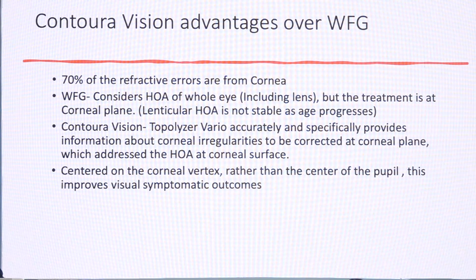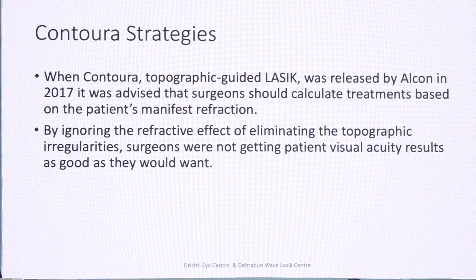Customized wavefront guided treatments would also include the lenticular aberrations. So if you have lenticular aberrations and you're trying to correct them on the cornea, it seems to be counterintuitive anyway. So Contoura, when it was born, was by Alcon in 2017. They advised that treatment should be calculated based on patient's manifest refraction. And by ignoring the refractive effect of the topographic irregularities, surgeons were not getting great outcomes.